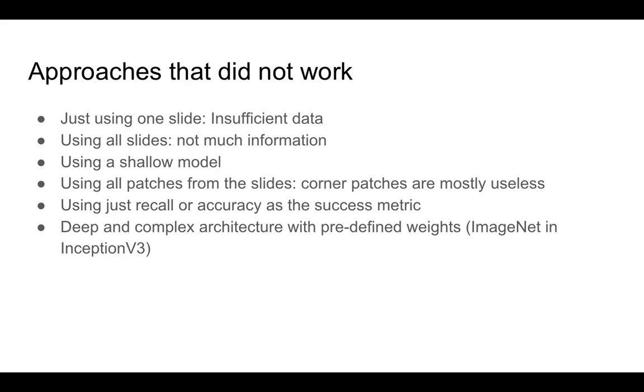Lastly, using a deep and complex architecture with predefined weights. So the one that I was using was Inception v3 with ImageNet weights, which did not really work well with this data set.